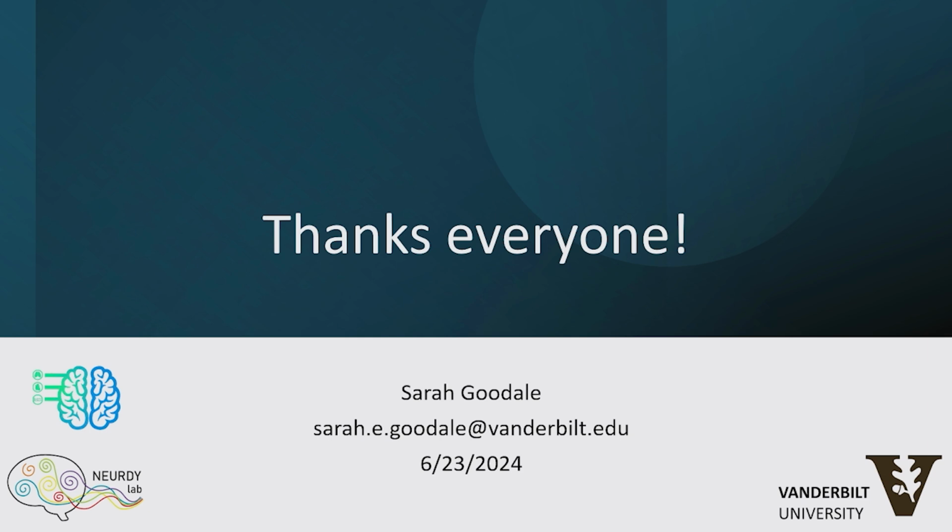That's what we typically do. Making sure, like was said before, the belt isn't too tight or too loose, and the PPG is on the finger well. If it's loose or you're worried it's going to come off, extra tape is always a good thing to use. But it's really just about checking the data quality before they go back in, and it's a lot harder to pull them out and restart them than it is to make sure it's good from the get-go.